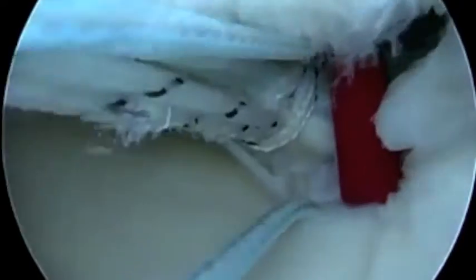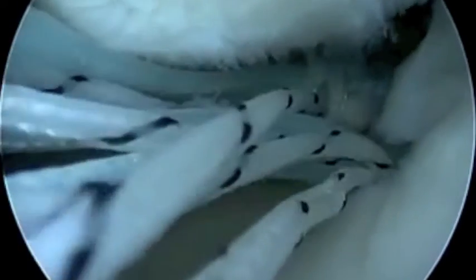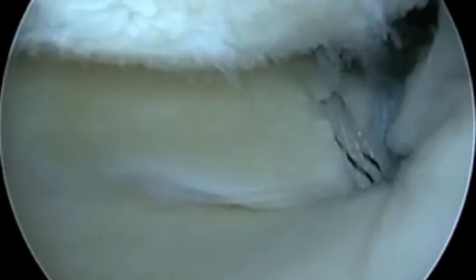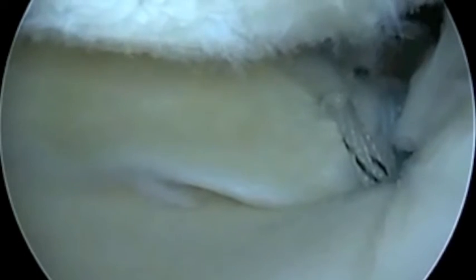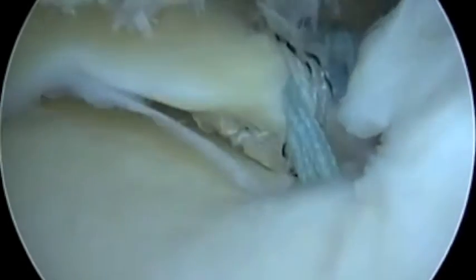We pull the meniscal sutures back into the socket through a bone tunnel, and there we get good cooptation. Here you can see how the sutures pull the meniscus back into good position to withstand the forces of the knee.